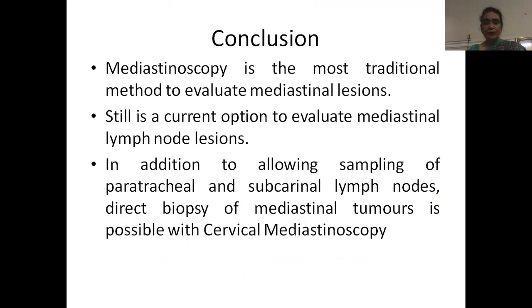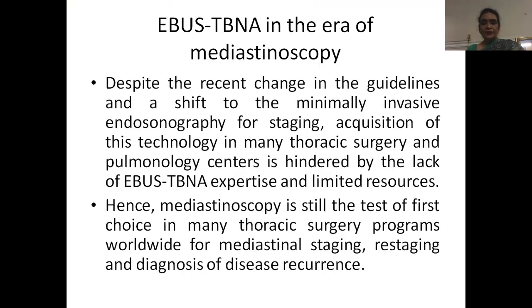In addition to allowing sampling of the paratracheal and subcarinal lymph nodes, direct biopsy of mediastinal tumors is possible with cervical mediastinoscopy. So despite the recent changes in the guidelines and a shift to minimally invasive endosonography for staging, acquisition of this technology in many thoracic surgery and pulmonology centers is hindered by the lack of EBUS TBNA expertise and limited resources. Hence, mediastinoscopy is still the test of first choice in many thoracic surgery programs worldwide for mediastinal staging, restaging, and diagnosis of disease recurrence.